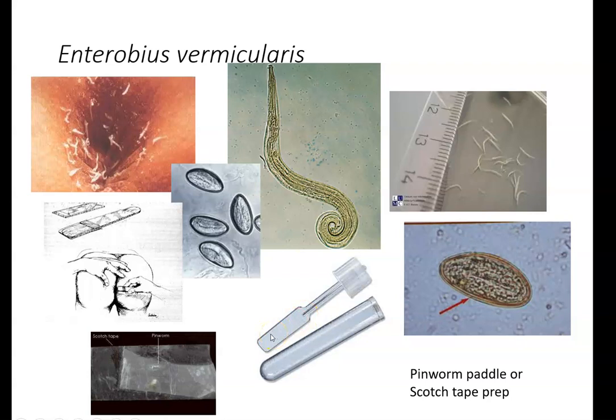So you take it, you put it between the anal folds, you take it out, and then what you do is when you get them in the lab, you can either use the paddle as a slide, or you wipe both sides of the paddle onto a slide.